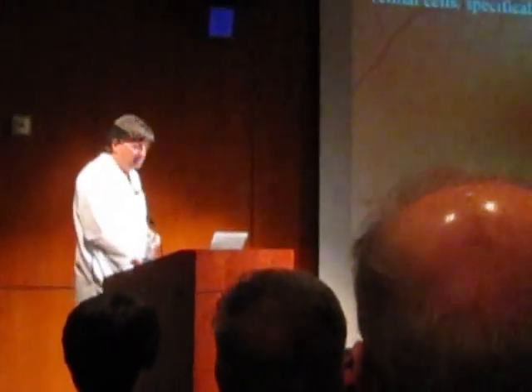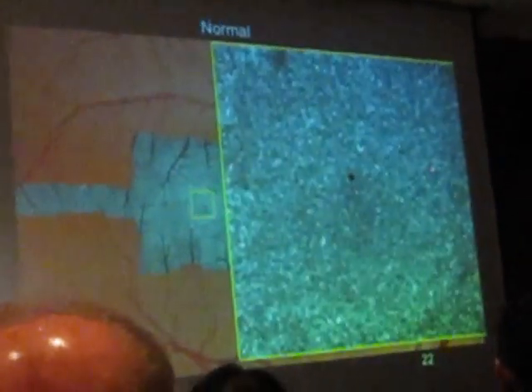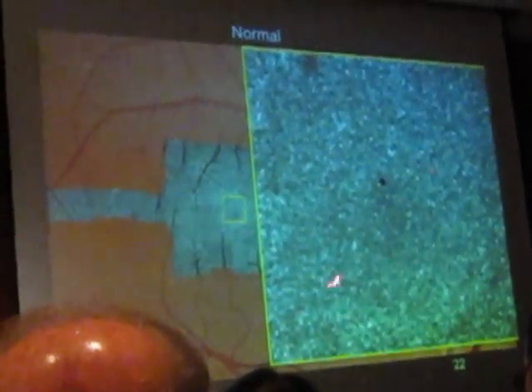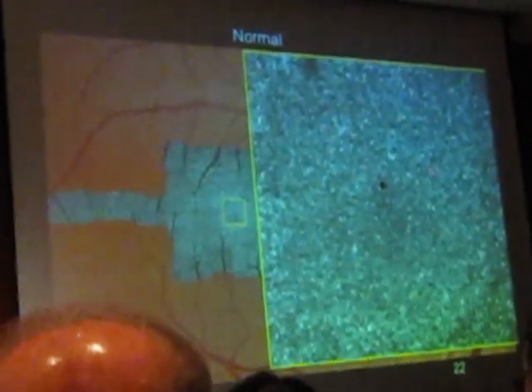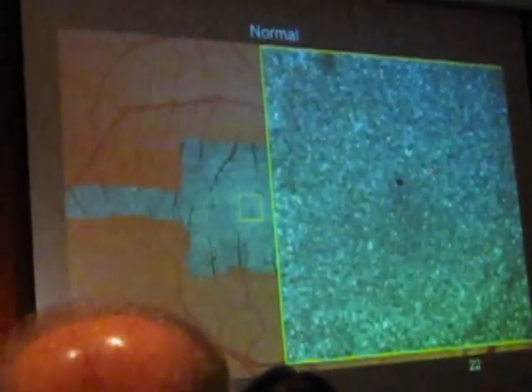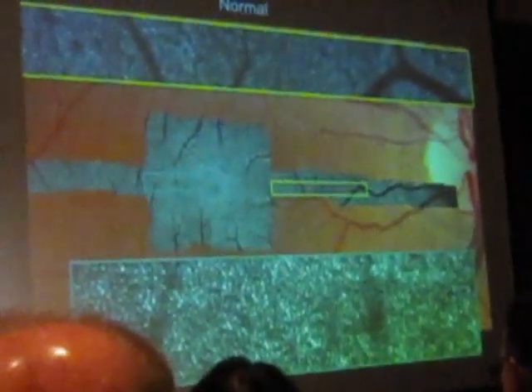So we can go through and look at these areas with a black and white photograph, and then take this yellow spot here, and look, these are the cones. That is a human cone array in the fovea, and that's fixation, the preferred retinal locus. So, an extraordinary capacity to look at different areas of cones in humans with disease.